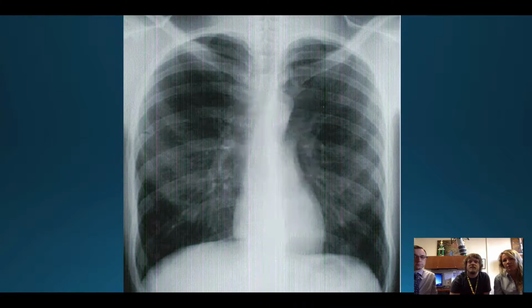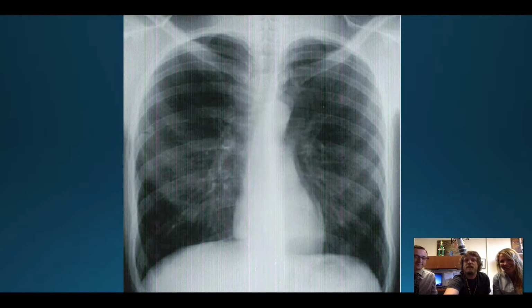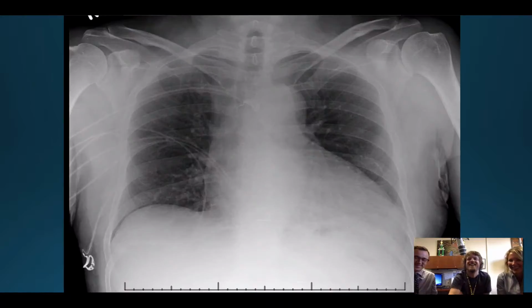And then we took a look at the heart. Ooh. Well, his heart's here. Whose heart was that? That was Mr. Bob's heart. Okay.